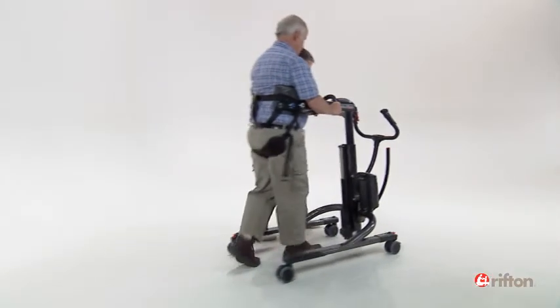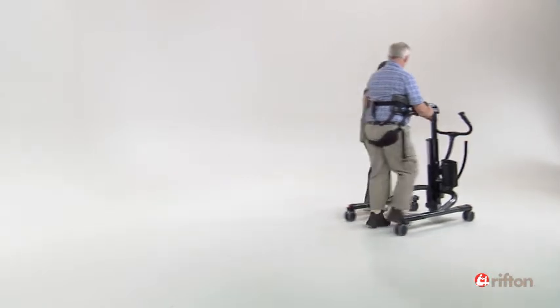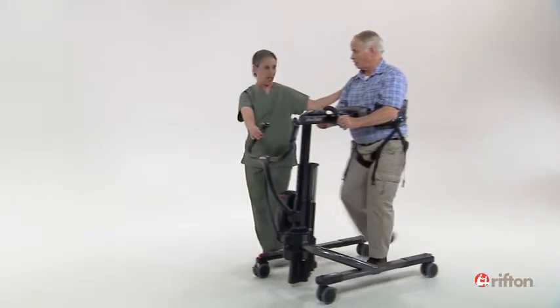Familiarizing yourself with the directional locks will offer you additional flexibility and assistance. It's another way the Riften Tram is designed to enhance both the caregiver and client experience.